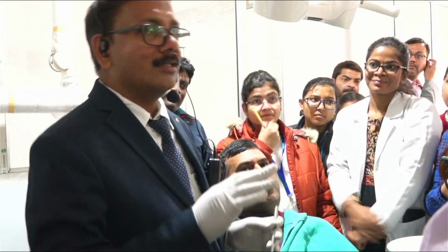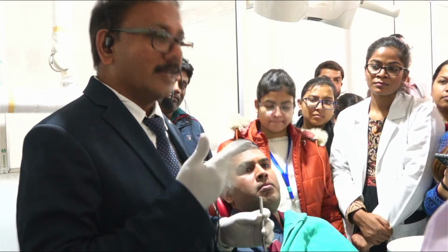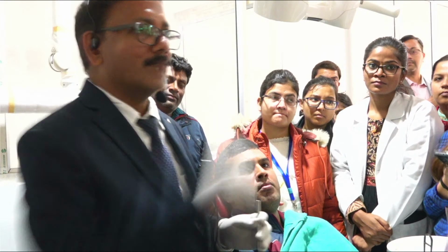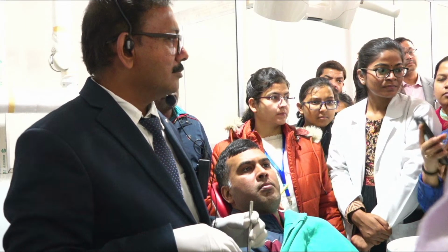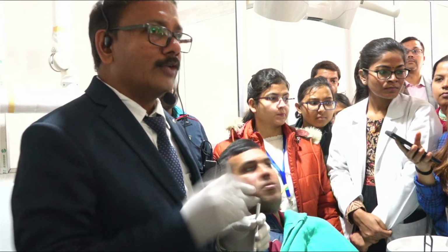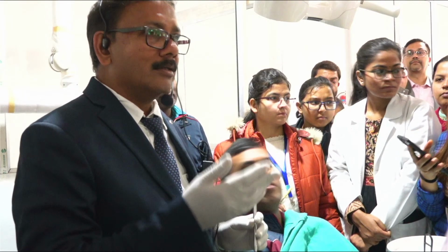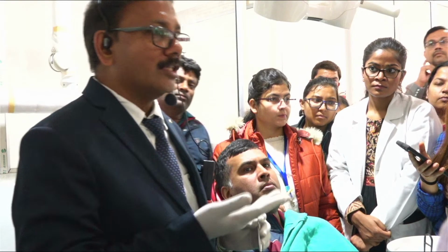You can see, the main primary objective is elimination of the caries bacteria. Cavitated or non-cavitated, in the bacterial presence, definitely you can try. You can remove as much as you can with the burr, and when you feel it is very close now, then go directly with PDT.